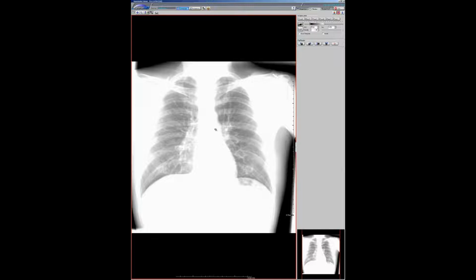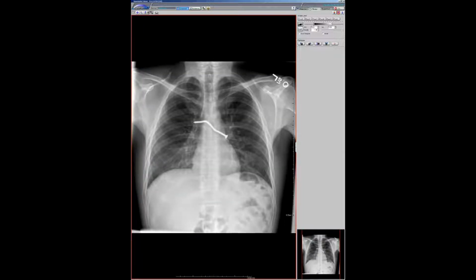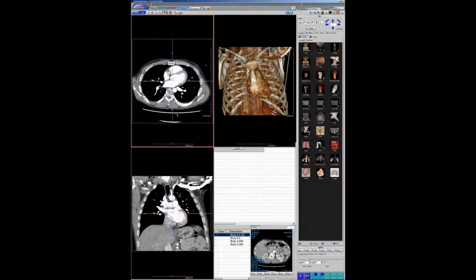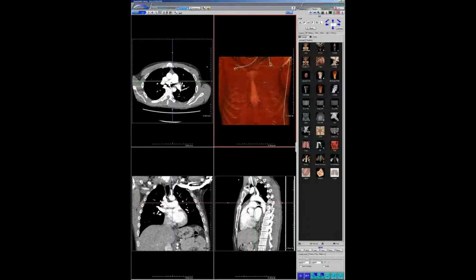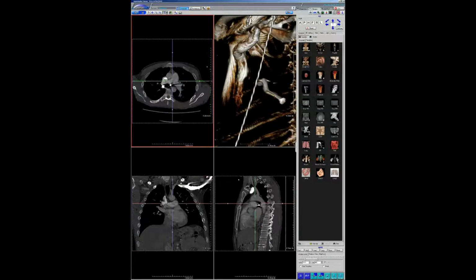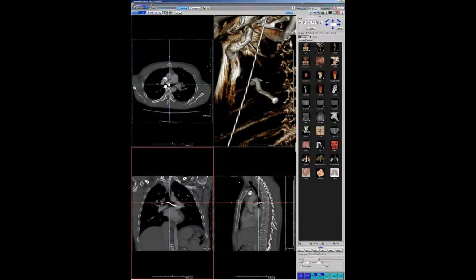So this nail is straddling the guy's trachea going into the main stem bronchi. Wow. He's a psych patient, and he decided to start inhaling nails as well as swallowing a lot of stuff, razor blades, nails. So if you ever wanted to see what a nail in the bronchus looks like, this is pretty good. Let me see if I can do a quick 3D recon. You can see it sitting right there. It's pretty impressive. I didn't think you could actually inhale a nail, but clearly you can.